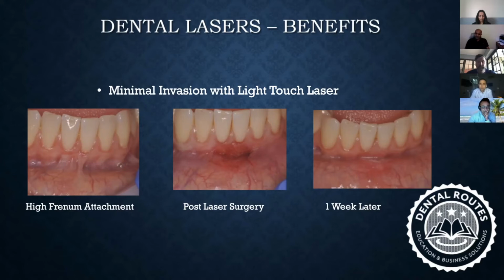Also, the energy that light produces seeps into each and every cell around. Any diseased or damaged cell, when you give it more energy, its repair becomes faster. It doesn't make a big difference to a normal cell. But when it is a diseased cell or a cell which needs repair, you give it some low energy through any kind of laser. That energy is absorbed by the mitochondria of the cell, and that helps the cell to create a hydrogen pump, which otherwise generally gets blocked. That is how the reparative capacity of the cell is increased. So the cell gets repaired much faster, and the healing becomes much faster as well.